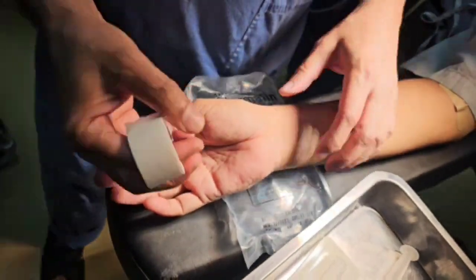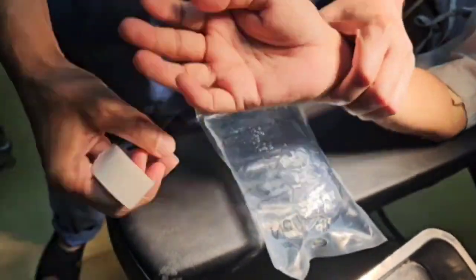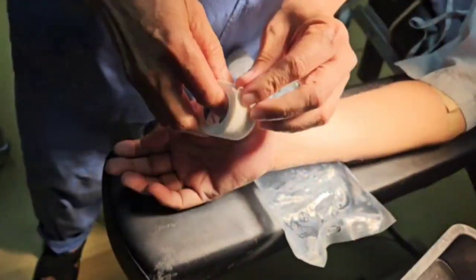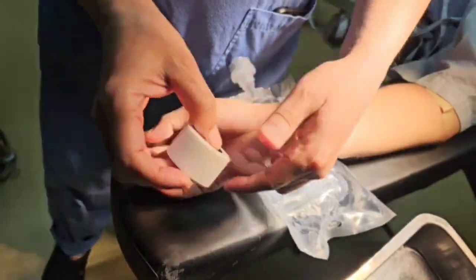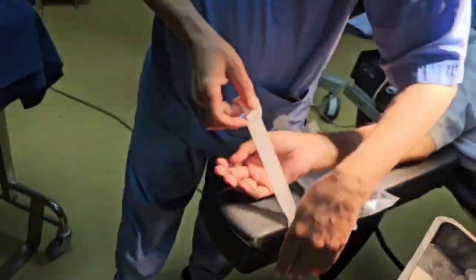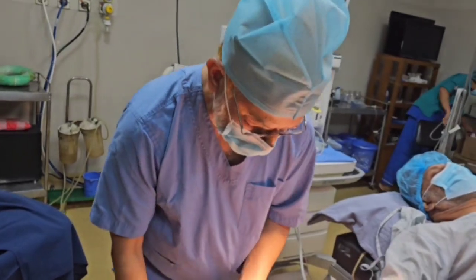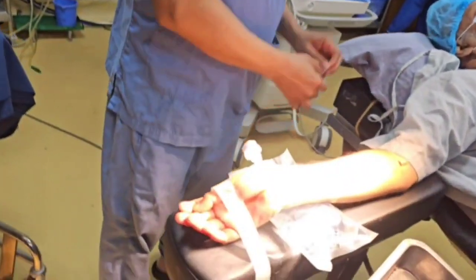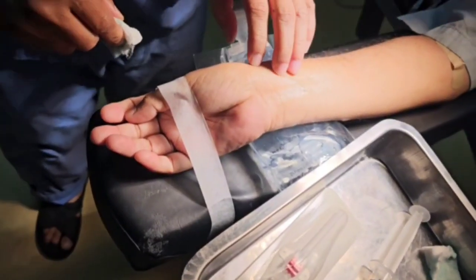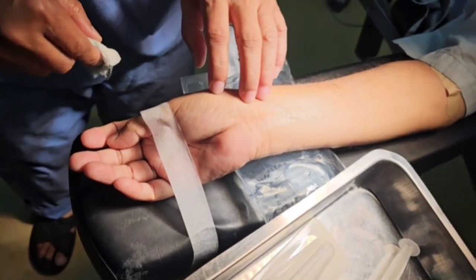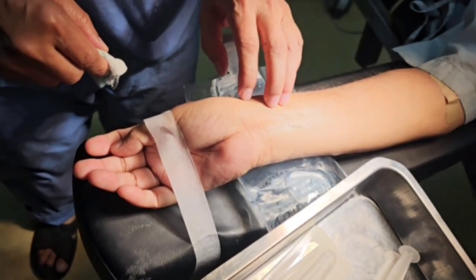Our intended position is dorsiflexion of the wrist with 20 to 30 degree angulation of the radial side of the forearm. This helps easier approach to the radial artery. Usually the radial artery is easily palpable between flexor carpi radialis tendon and styloid process of the radius bone. Sometimes we need to palpate the artery with bare hand for better feeling.